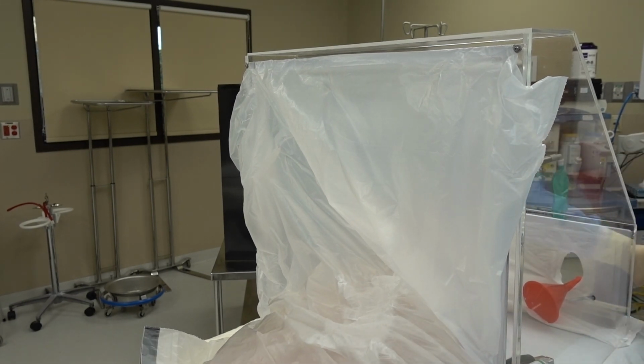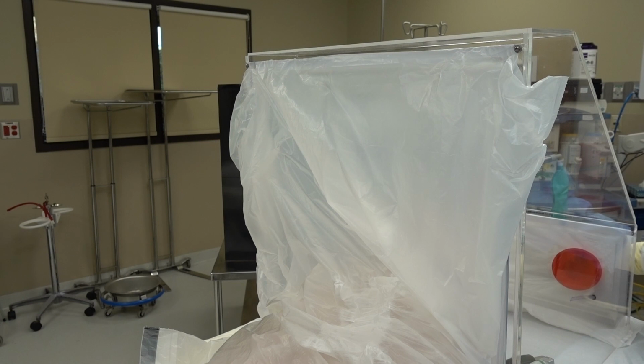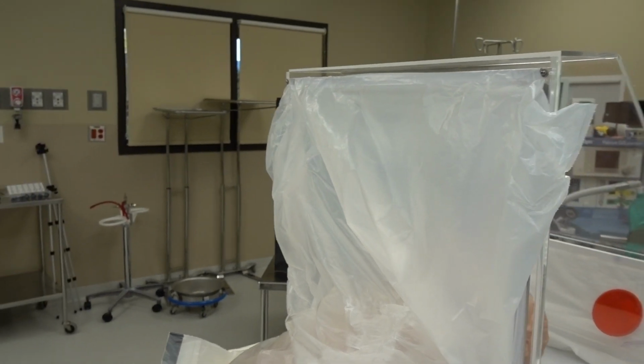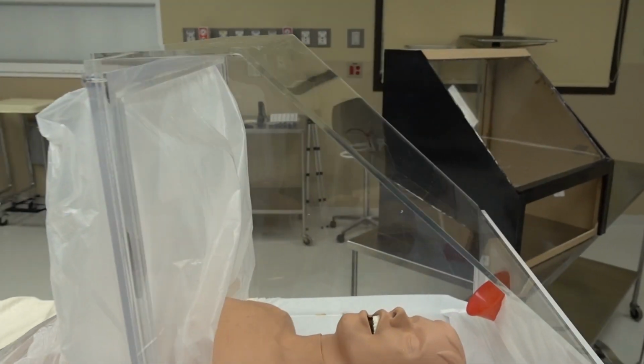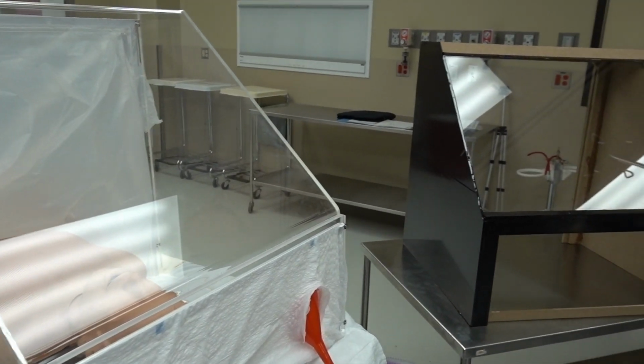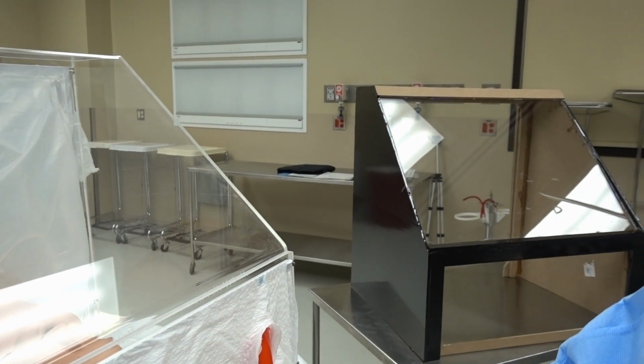And again, these would be taped in or sealed. You can literally use duct tape if you had to and just slap it on the back, and with the negative pressure it'll hold it. But we felt like this gave us a quick, easy way. You just tape it and you're done. We've got 2 designs. This one's a little more sophisticated to manufacture because it's routed out and the size has to be pretty good, pretty perfect.